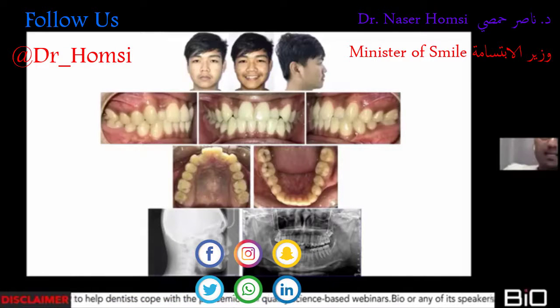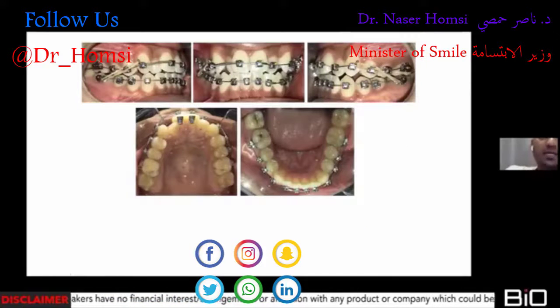So let's go on to the next case. Now this case again, as you can see, moderate amount of crowding in the upper incisor area and a decent profile to begin with. The teeth inclinations are pretty standard. So what I did in this particular case was use anterior bite blocks and these mild class 2 elastics over here, and gained some space the regular natural way. Now, again, use of a conventional bracket in this case may not have made any difference. It's a question of extracting or not extracting. That is the primary concern.